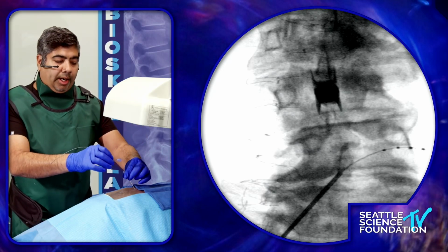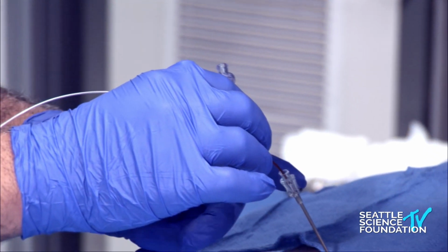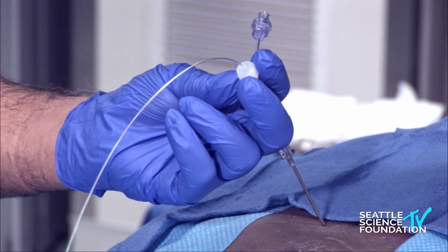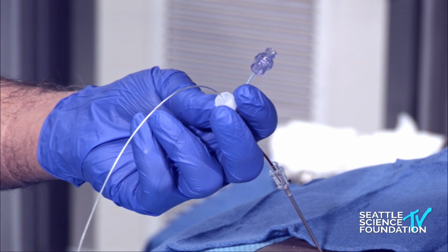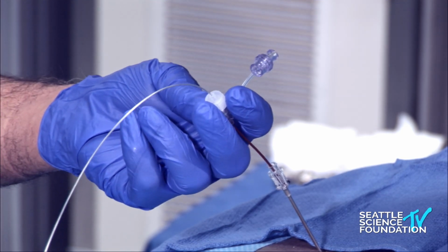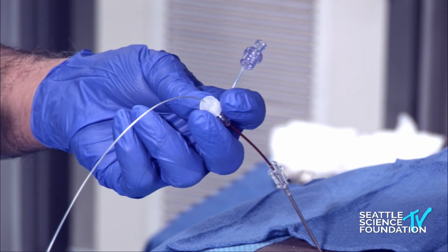So once you have parked your electrodes, you want to basically move the needle so that the black mark on the Tuohy needle faces 12 o'clock towards the head. You want to hold on to the extension. And I always say the job of the driver is to basically carry your lead wherever you want to. But once the job of the driver is done, the driver needs to come back to the parking spot. So where is the parking spot? The parking spot is the bevel of the needle.